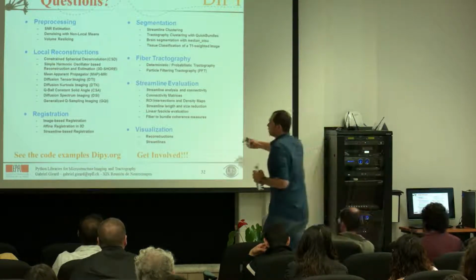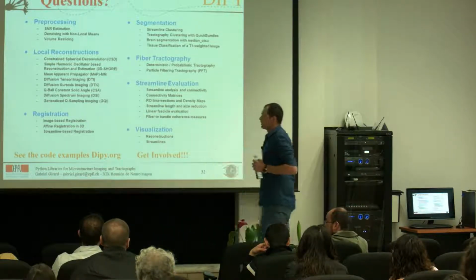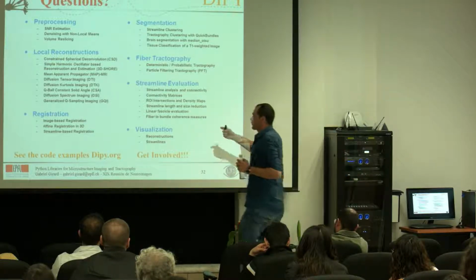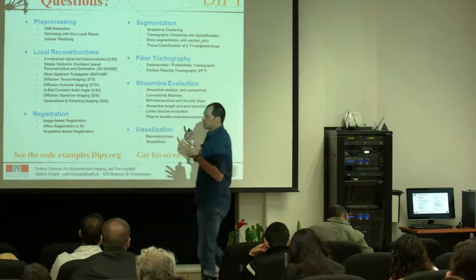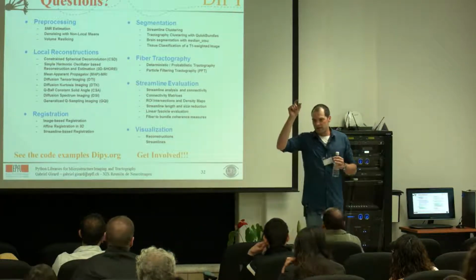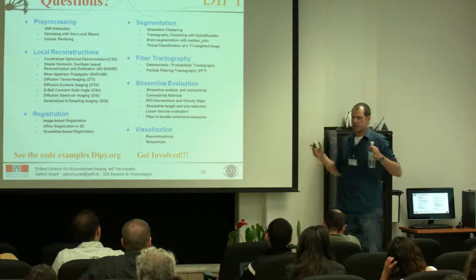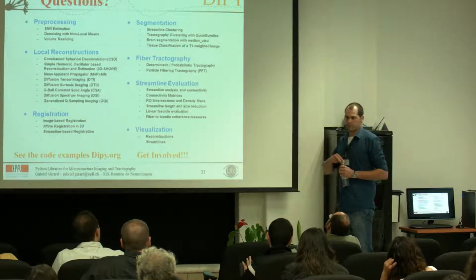But as you see, the local reconstruction part is very, very good in DIPY. A lot of techniques, probably the software that has the most together. And if you want to compare these techniques in some way or get scalar values out of them, you can do it very, very easily, where you just essentially declare all your models, fit them, and get the values. You know that you're in the same space, in the same framework, and this might be very useful.